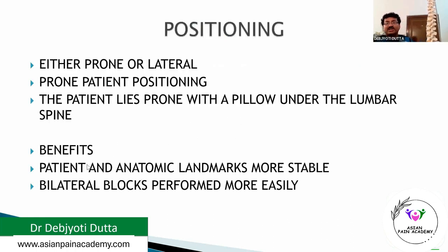Now, the patient is placed prone and we have to put a pillow below the abdomen to make the posterior part of the vertebra stretched and to reduce the lumbar lordosis.